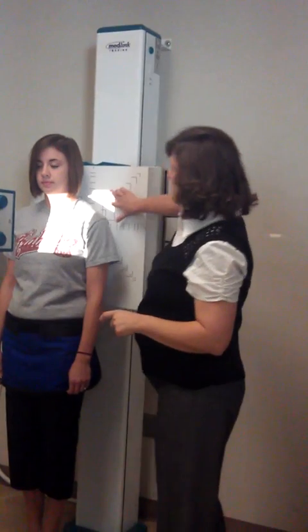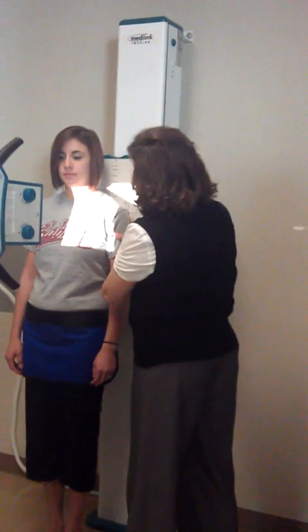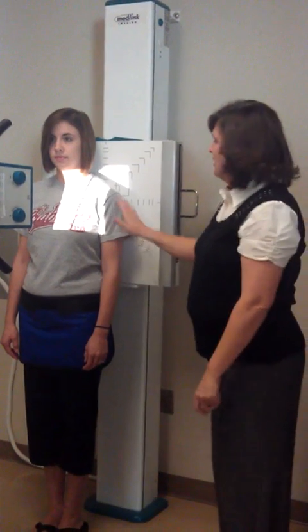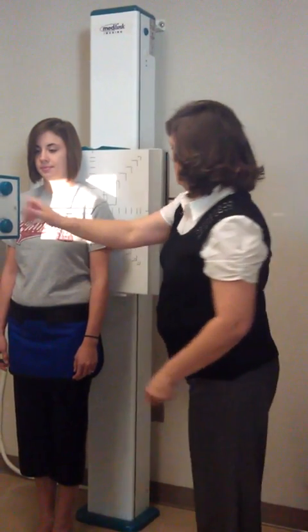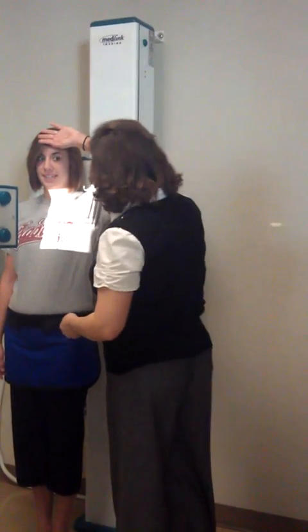I've got my light field about two inches above her shoulder. What about two inches from her lateral border? Not from her shoulder. So don't place it two inches in from her shoulder — it's from her ribs. You take her and do your arm.